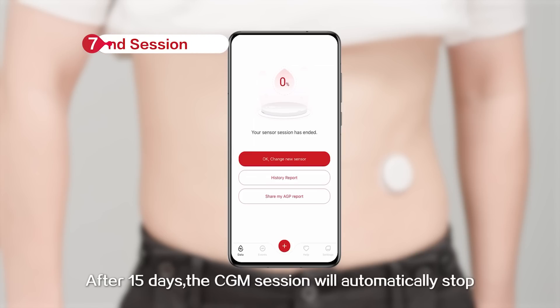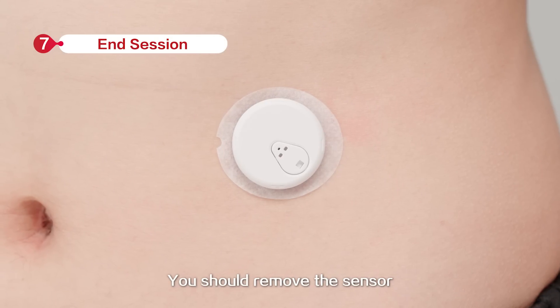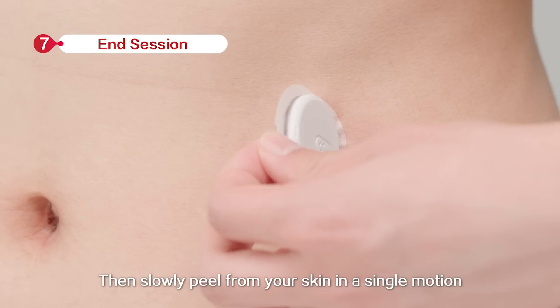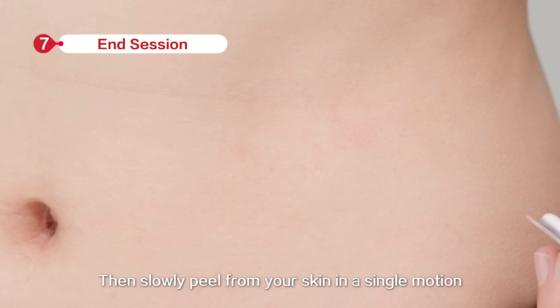After 15 days, the CGM session will automatically stop. You should remove the sensor — pull out the adhesive edge, then slowly peel from your skin in a single motion.